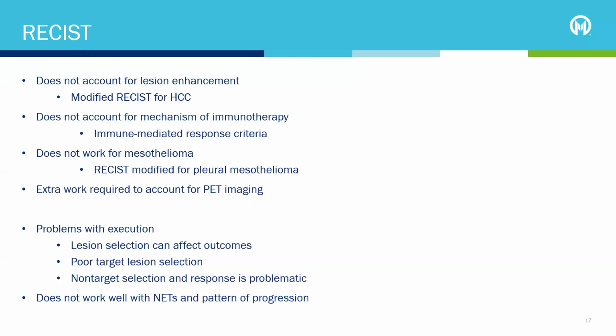In reality, it's a complete response. The tumor is completely dead. So you can see that pretty big difference in outcome right there. And this happens in RECIST trials. And so there's been multiple modifications to RECIST. People get very frustrated because they think their patient's getting better, but the RECIST criteria are not reflecting that.